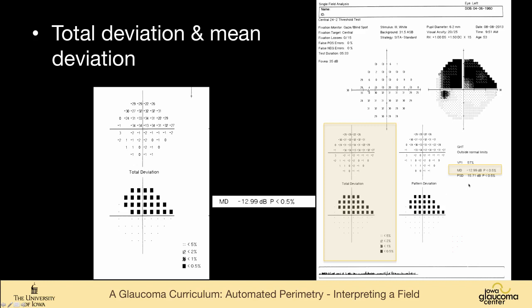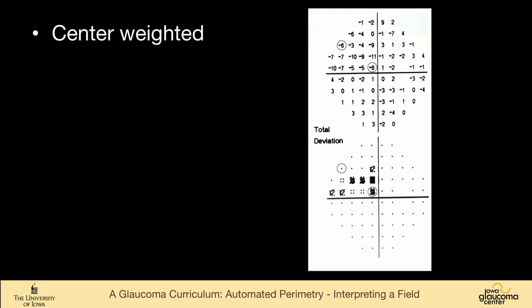And then the mean deviation over here is the center-weighted average of all of these points here. So again, the central points are more reproducible and more important, and so this number is center-weighted. And so on average, this person is down 12.99 decibels, which is highly significant at a p-value of less than 0.5%. So this point, 13 decibels is less sensitive than expected for a 53-year-old.